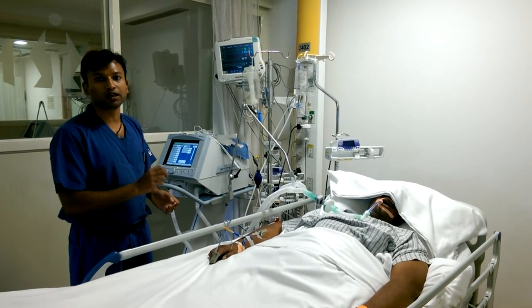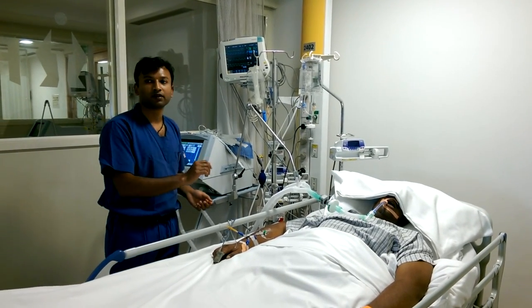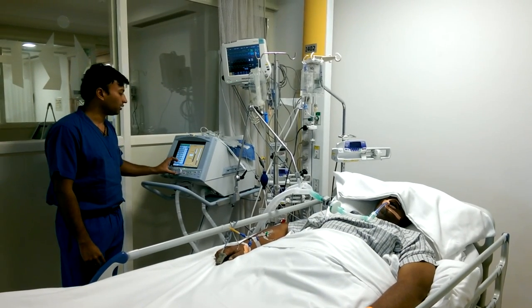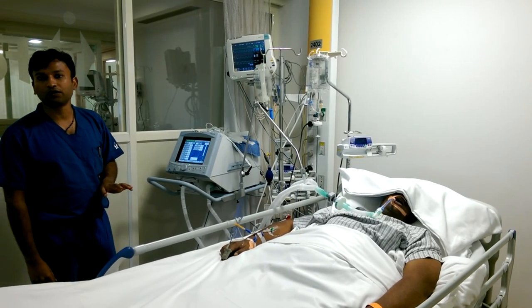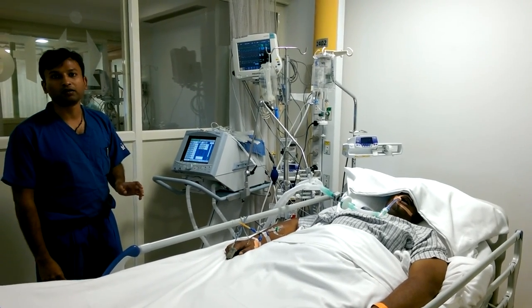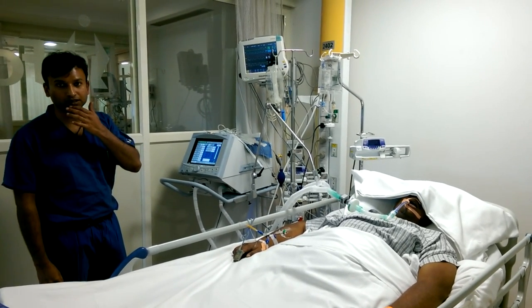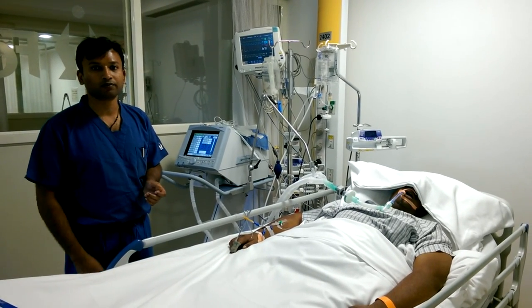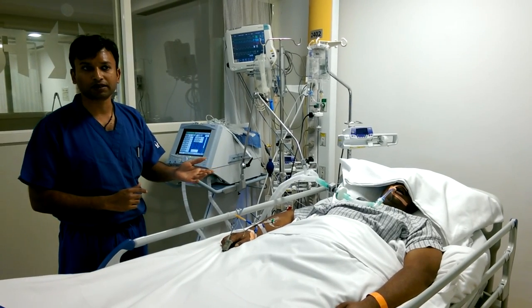First, we'll pre-oxygenate the patient to 100% saturation by a catheter, or we can increase the FiO2 to 100 and pre-oxygenate for some time. This is mainly done because during the apnea test, we do not want any desaturations. So, after pre-oxygenating, we'll take a baseline ABG.